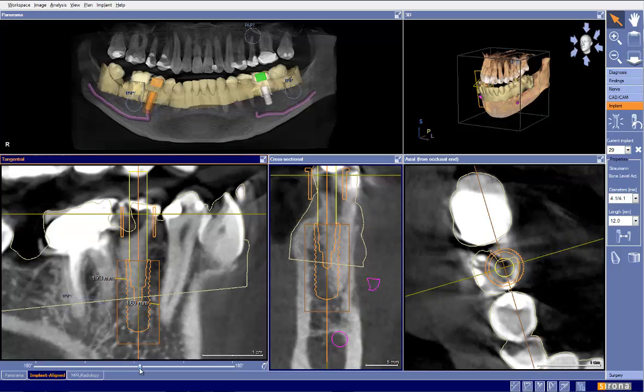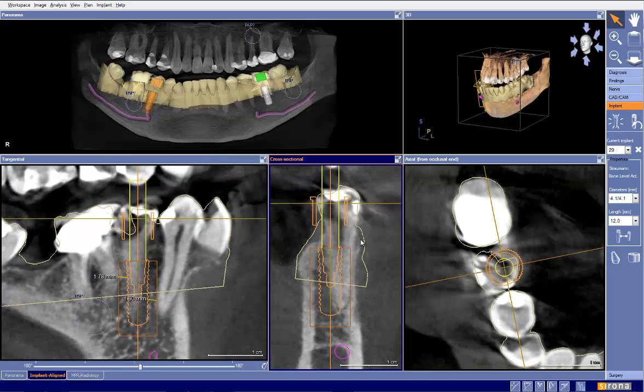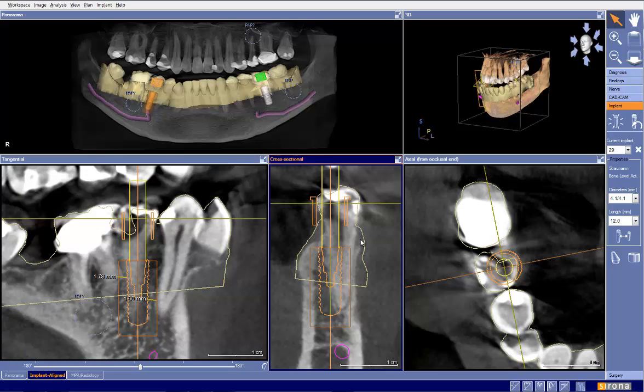The key factor in number 29 is removing it while maintaining that buccal plate. That would involve periotomes, proximators, trying to do an atraumatic extraction, apical retention forceps, and no buccal pressure whatsoever in removing that tooth. So thank you very much, and I appreciate you sending the case in.